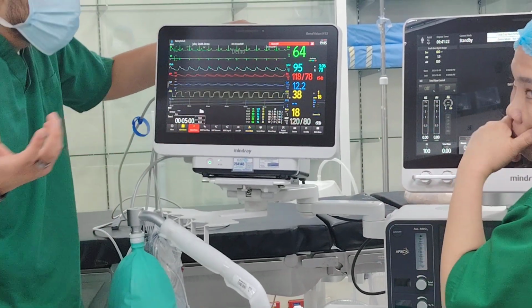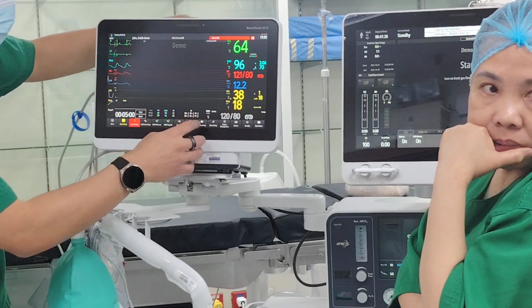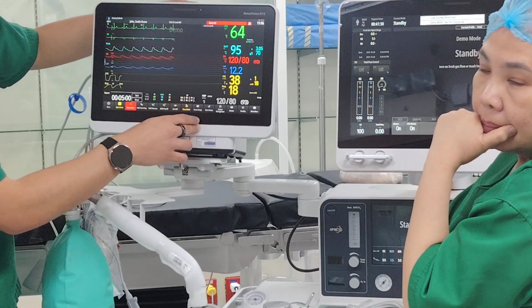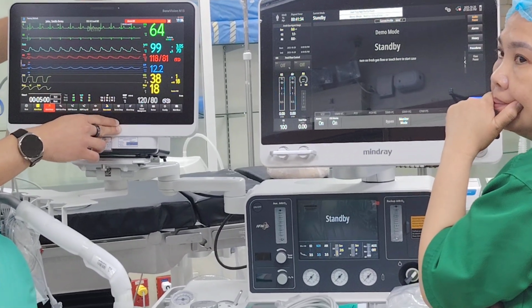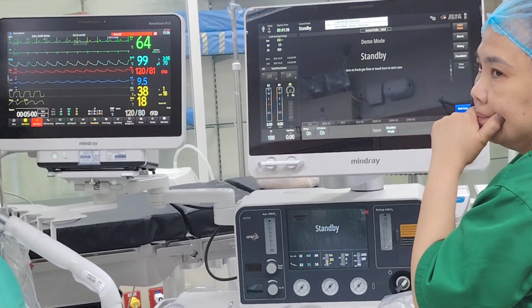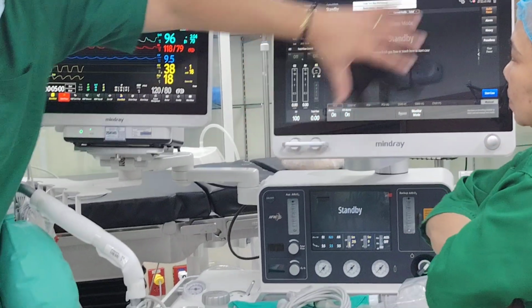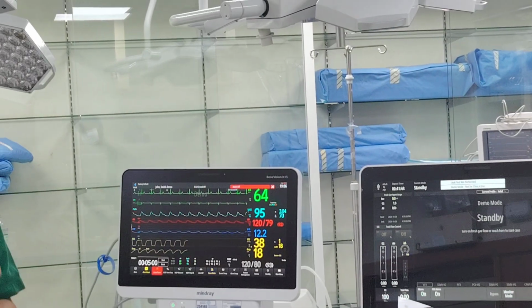I'm not the one who picks it. Because our boy requested the machine, not the esophageal. This is the new machine, new model. It's the same model, a new machine. Okay, A9. So what I explained to you today, you already have it over there, but unfortunately I think maybe none of my colleagues came and explained it to you.